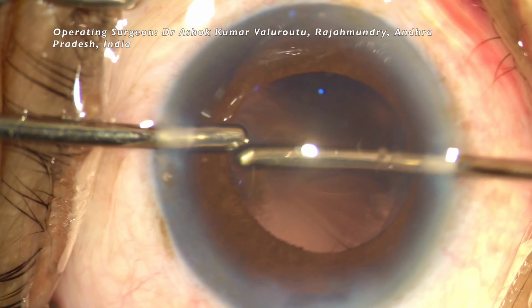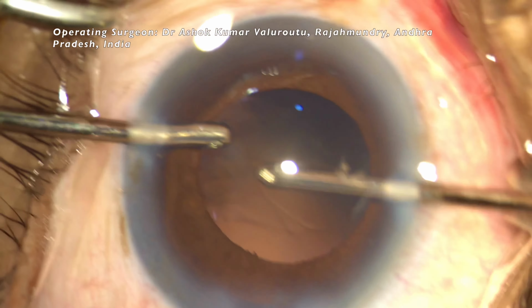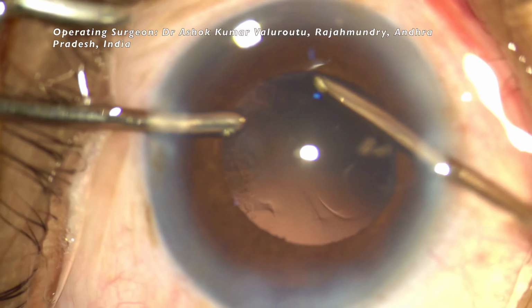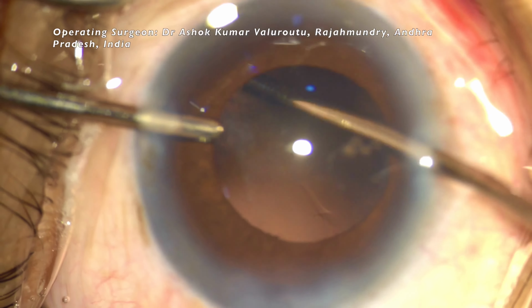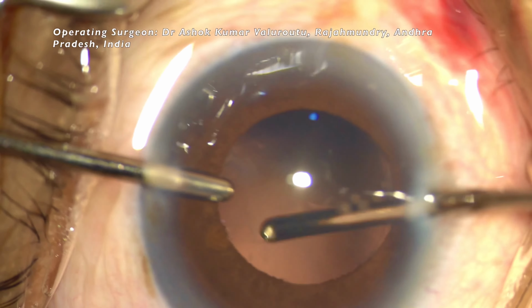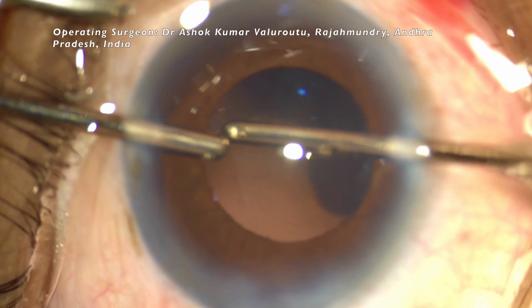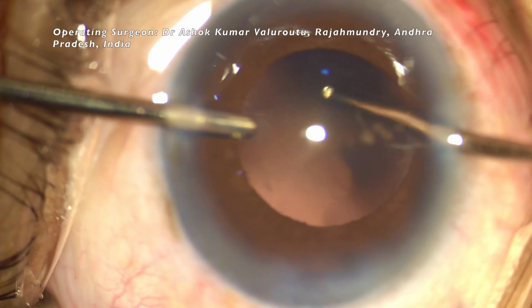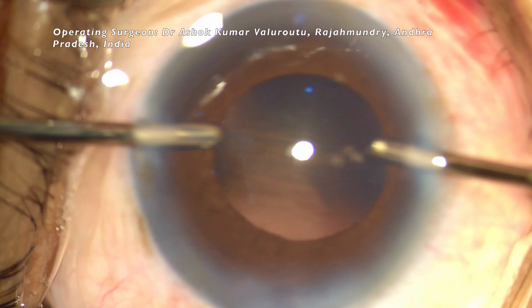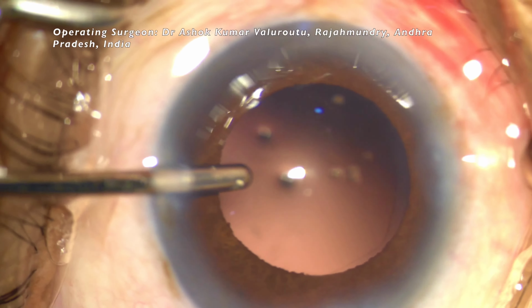Now any remaining cortex that is present is aspirated with irrigation and aspiration. After the irrigation and aspiration, making sure that no cortex is left behind, I am planning a hydro implantation of the lens. So for hydro implantation, the irrigation cannula is left intact.